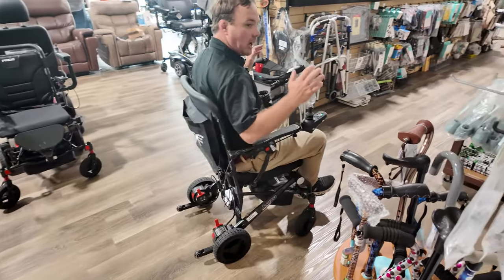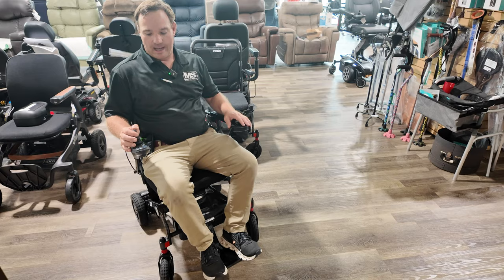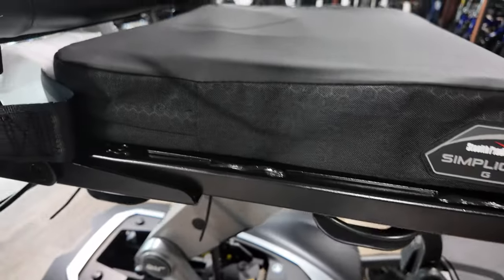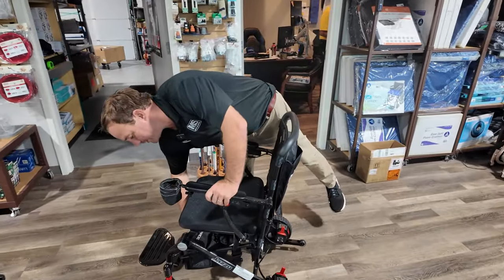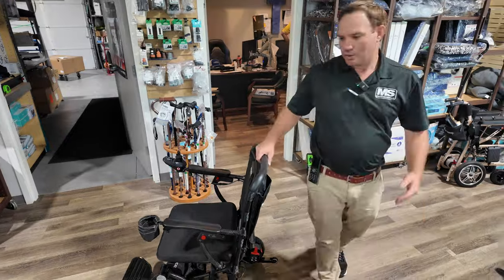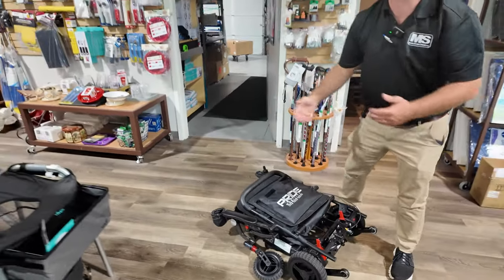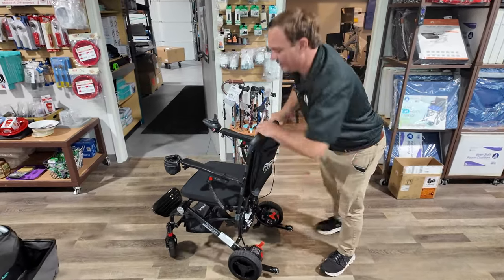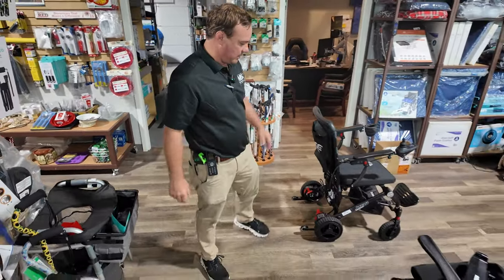With me, you're also going to get a bottle holder for free and I'll upgrade you to the better cushion. This folds up very easily, the battery can be removed to take inside and charge — it's very lightweight. You can fly with this; it's airline friendly. We had a customer go to Norway and Greece with it. It folds down by just releasing the latch, picks up at about 39 pounds. To unfold it, take it here. It has brakes so you can push someone like a transport chair.